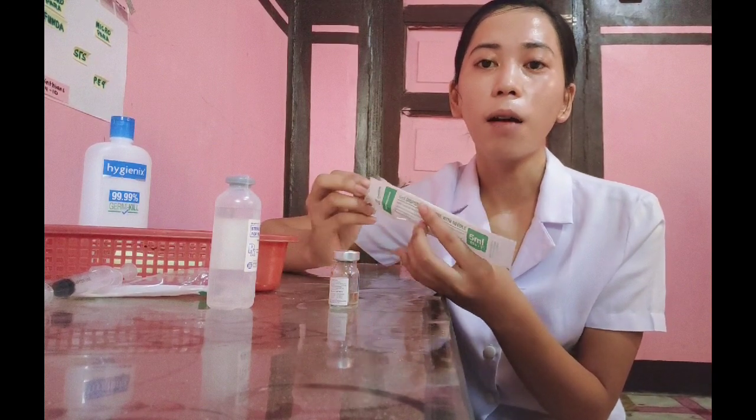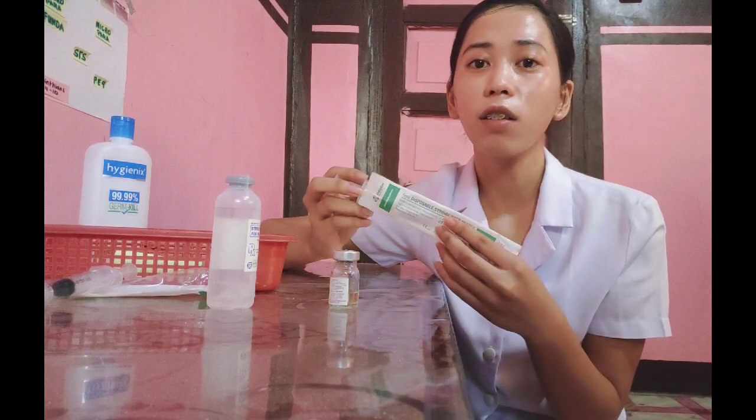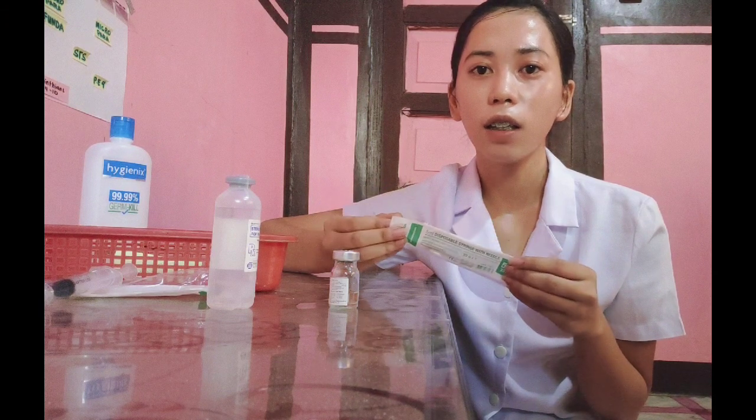And then if giving an injection, replace the needle with a new one of the correct gauge and length. And then eject the air from the new needle and verify the correct medication volume before injecting into the client.